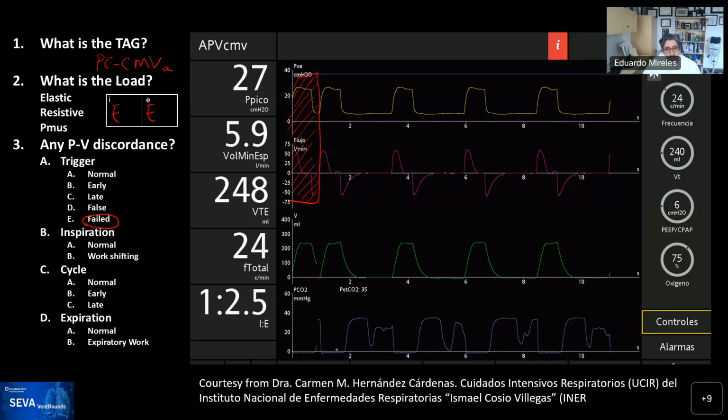Although now, with the knowledge, you start seeing perhaps a little undulation there. But the key is the end-tidal CO2. The teaching point is that during inspiration you see 0, because there's no CO2 in the air that we're inhaling. Then when the patient exhales, it goes up and finds a plateau.